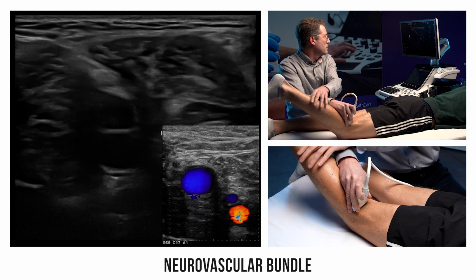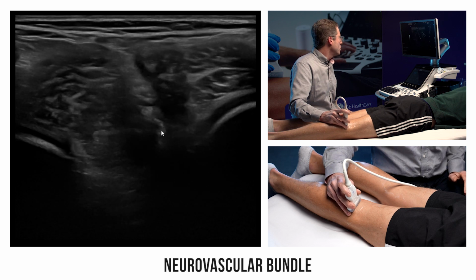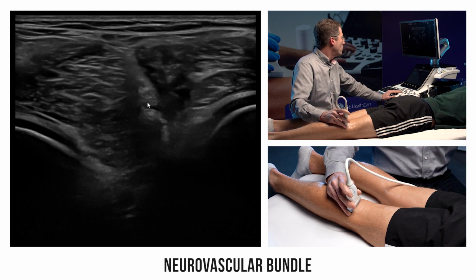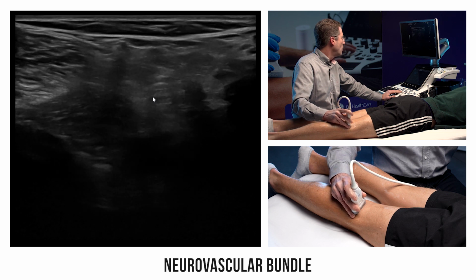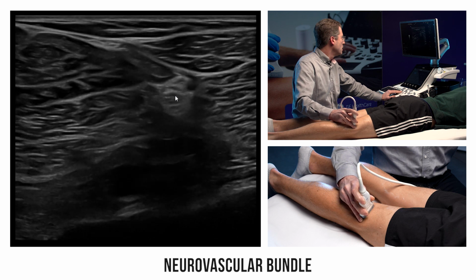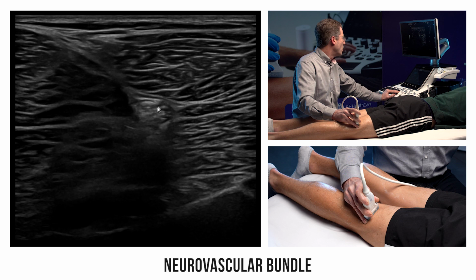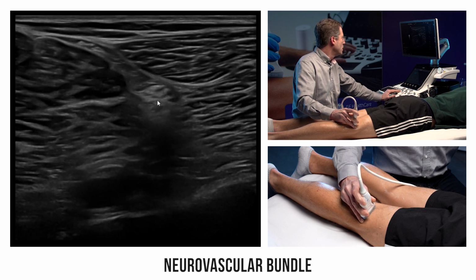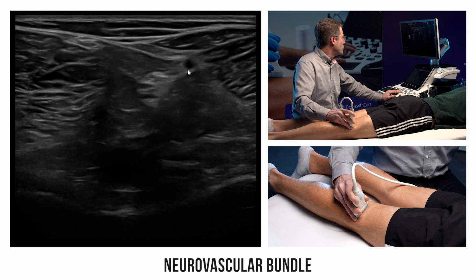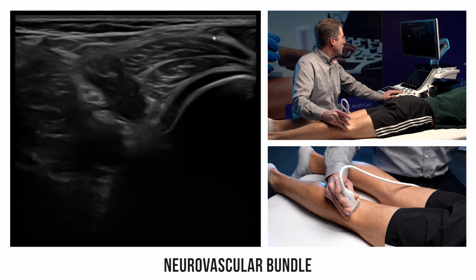We will now try to analyze the nerve structures superficially with the tibial nerve. We can use the elevator technique to go up to the sciatic nerve, which we see here under the biceps femoris, and then go down to follow the common fibular nerve under the muscle belly of the biceps into the lateral compartment.